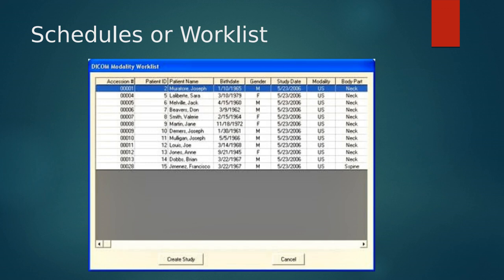So on our systems, we are going to have a DICOM organizational platform. What DICOM does is it keeps all of a patient's information together. You'll definitely learn more about this in one of your Medi courses, but it keeps everything aligned so that everybody within the healthcare system can reach that patient's chart. It keeps all of their imaging together. It keeps all of the important things for radiology together. So we're using a DICOM system pretty much wherever we are.